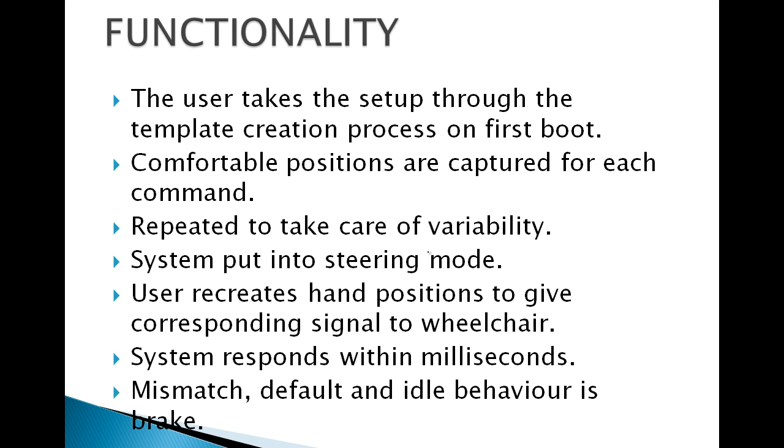Regarding functionality, typically the user goes through the setup process so that the system becomes accustomed to his preferences on the first boot. Comfortable hand positions should be created so that they can be easily reproduced, and these positions are repeated up to 4 times in this current implementation so as to take care of variability.